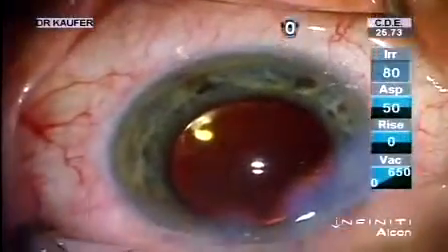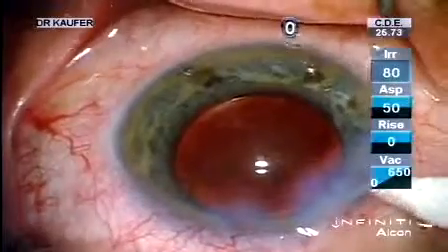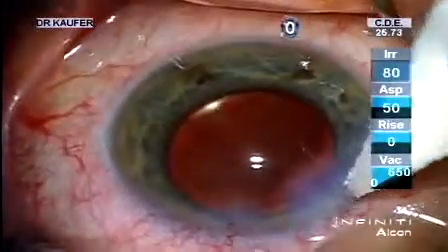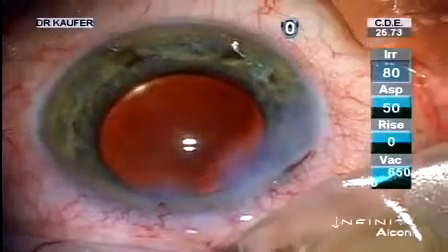We have now a very firm eye, and we're going to make sure that the incision is sealed. And as you can see, that is a tight wound, and we're not having any kind of filtration.